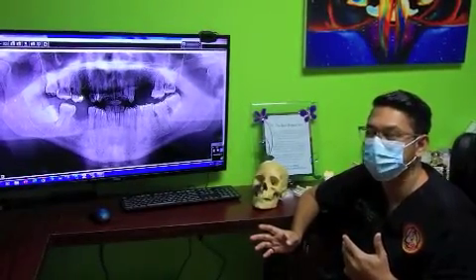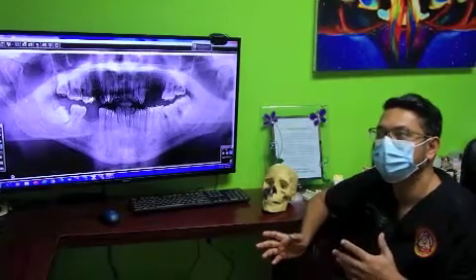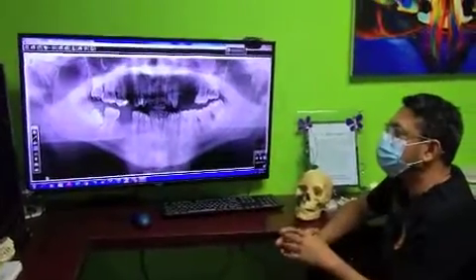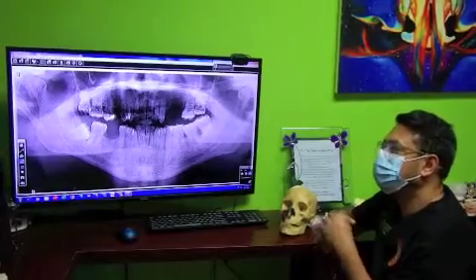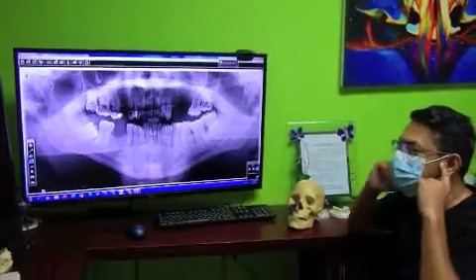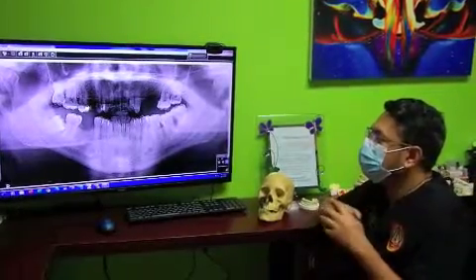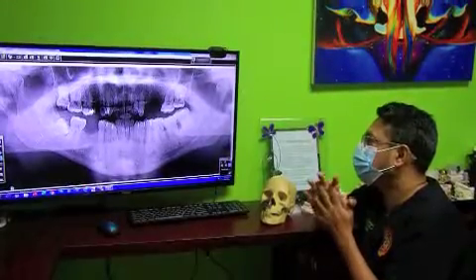One of the best tools I find to assess a patient's overall occlusion is definitely a PAN, an OPG, right? And we use it routinely in private practice for that purpose. A PAN would give you a whole context of not just teeth, but teeth with bone in the oral apparatus, with soft tissue. Patients, of course, are not just a combination of teeth. They're made up of neuromusculature, muscles that work together with the TMJ joint, and informed by parafunctional issues at times.